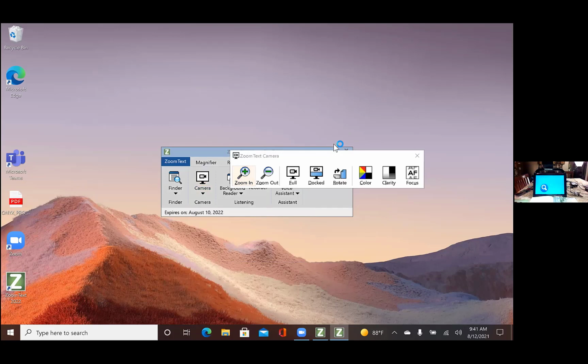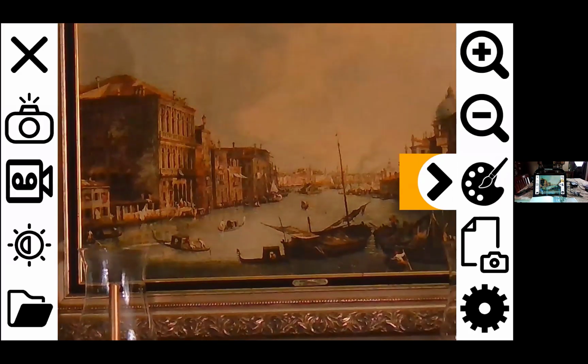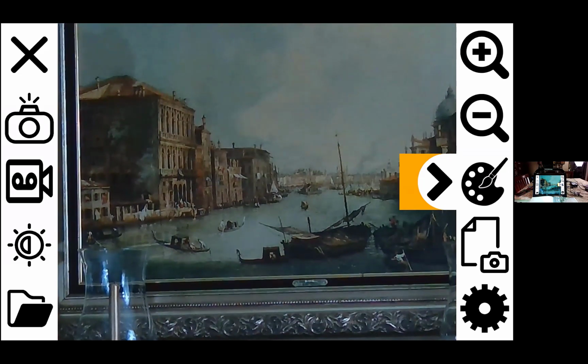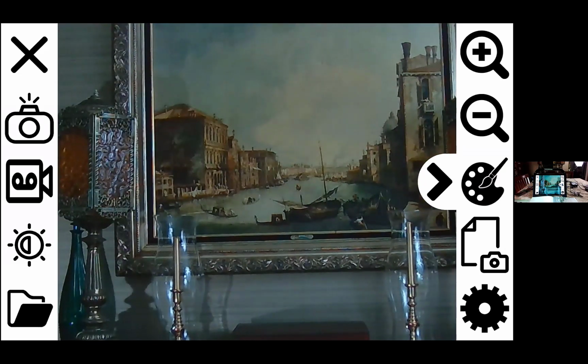Horizontal split. Yep. And that automatically opens up the Onyx Pro software for you. Right. What does, when I did full view there for full camera. Yeah, exactly. And that takes you into the full native app Onyx Pro software without a split view. Right, from within Zoom text, which is really nice. It's seamlessly designed that way, which is nice.